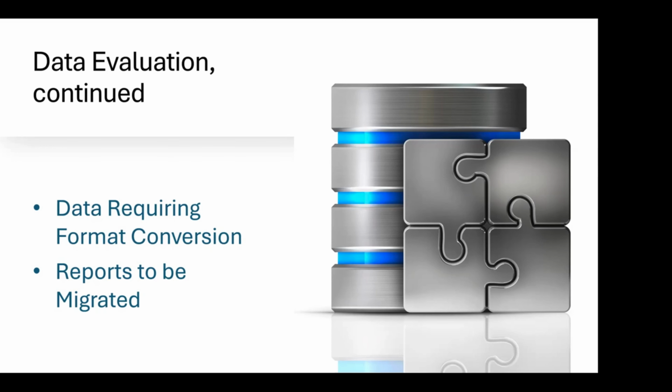It could be available in the legacy system. As the ORU was sent into that system, they may have been converting them automatically to DICOM SRs, as a basic or enhanced DICOM structure report. So all of these things you should analyze and say, how are we going to get them?